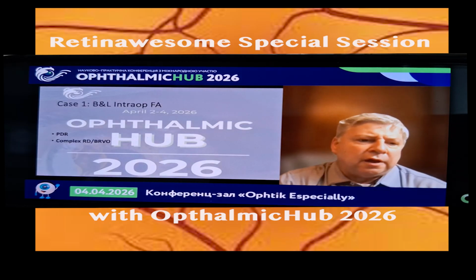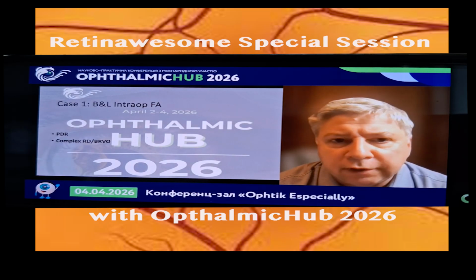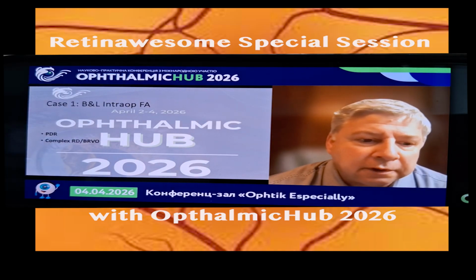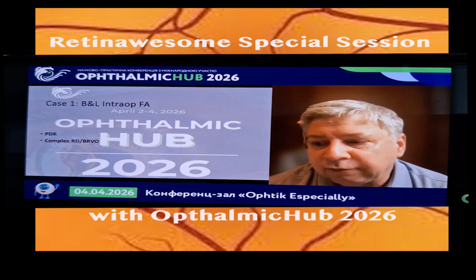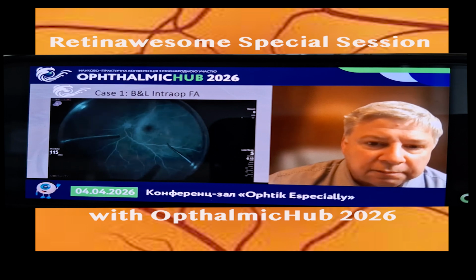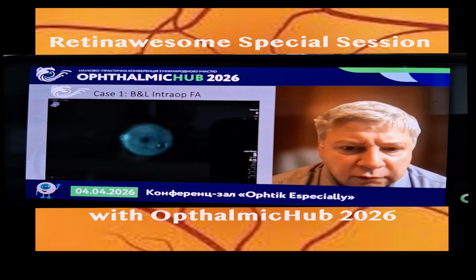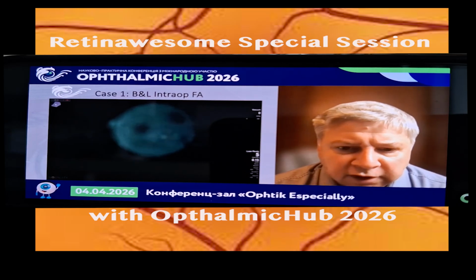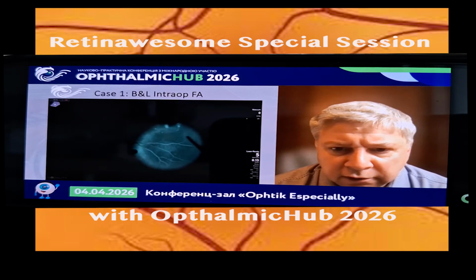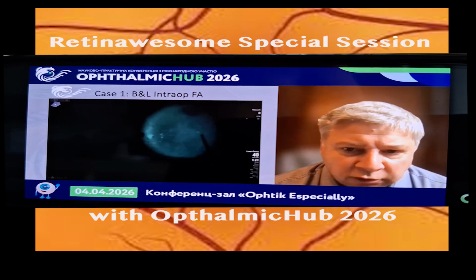The first case is basically, we've been working on fluorescein angiography. Typically, we've been using the Alcon system, which is a great system, but the question is, how does fluorescein angiography work on other platforms? So I'm going to show the Bausch & Lomb platform. This is the Stellaris. We've got the exciter filter in the Stellaris. We're using the Ingenuity monitor here, but this is light from the Stellaris, and it works nicely.